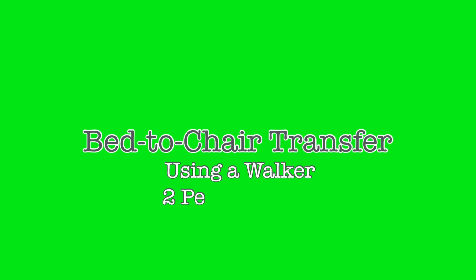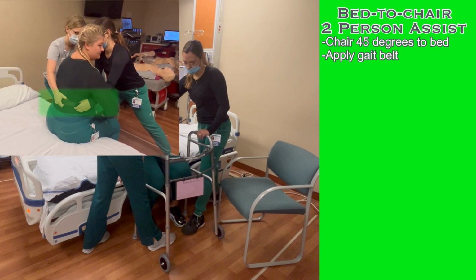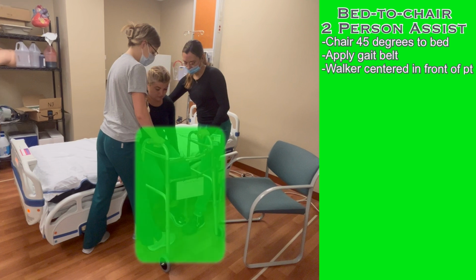If the patient requires two-person assistance, utilize this technique to get the patient to a standing position with a walker, and transition to a chair. Position the chair angled toward the bed, close to the bed but appropriately spaced to allow the patient room to maneuver the walker as they transition to the chair. With the patient in a seated position at the side of the bed, apply the gait belt. Place the walker in front of the patient.